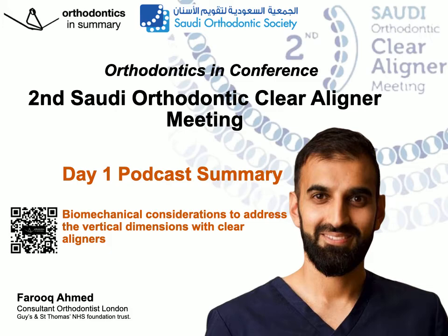Now he described how torque lags behind with aligners, and he gave the analogy of actually an aligner is very much like using a rectangular nitinol wire. We will eventually get the expression, but it can take some time. He mentioned when it comes to having root tip taking place, opening up 0.2 millimeters of space adjacent to that tooth, both mesial and distal, allows more plastic to engage in the interproximal points, and therefore we can control the root tipping that occurs. He went on to describe buccal root torque.